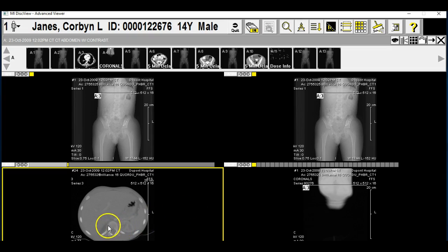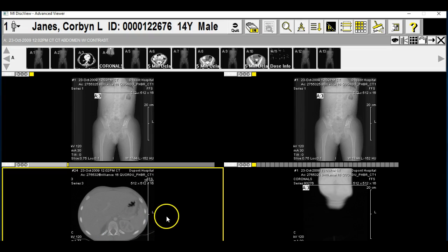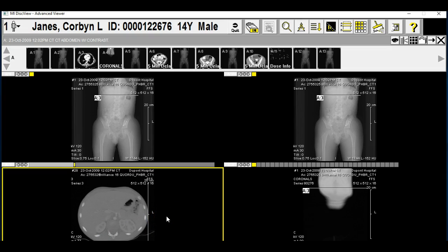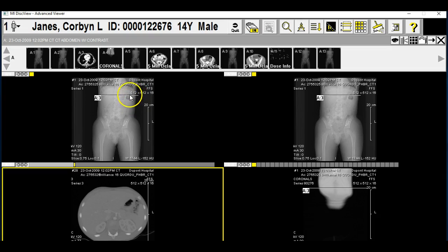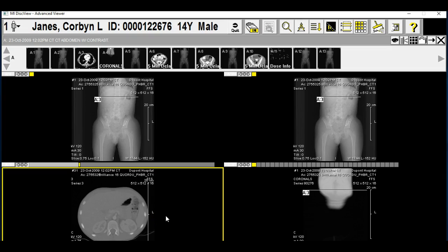Here you can see the spine and the vertebral column. And here you can start to see the kidneys — there's one kidney over here, and we have another kidney. If you look up top here, you can see that's about where the kidneys are. We keep going down and we see more of the kidneys.